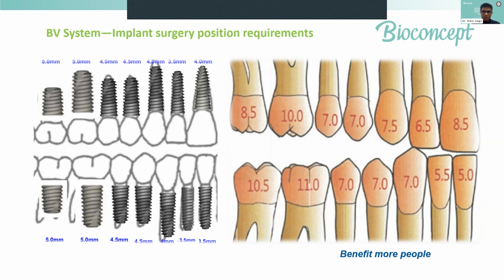Like you have seen in the X-rays that we showed you, most of the implants are in that diameter and that length, which have shown almost zero to near zero bone loss and good functional efficiency in the intraoral scenario.